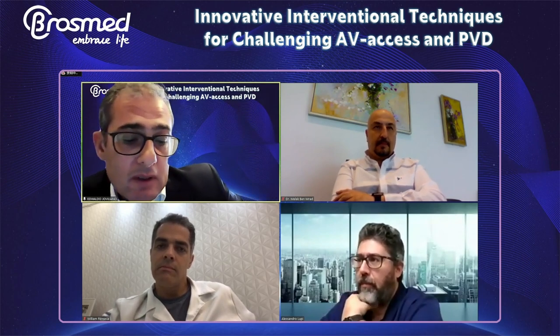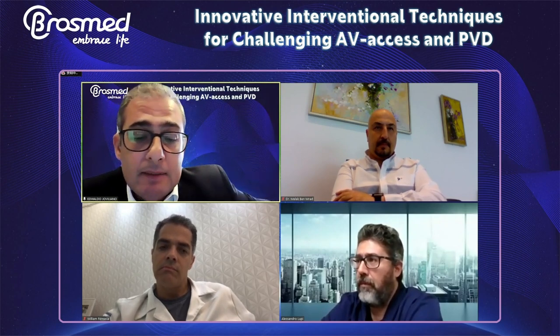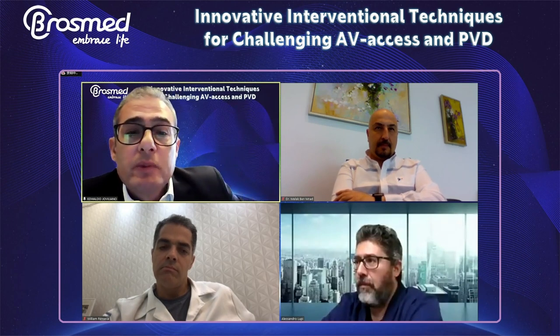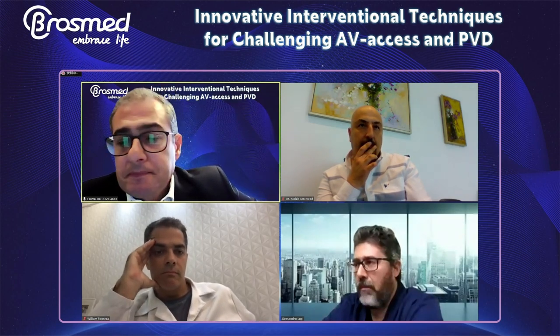Absolutely agree, Dr. Alessandro. Thank you for your comment. I think the scoring balloon is very good to prepare the vessels for the drug-eluting balloon. In our opinion, we have to avoid stents as much as possible in femoropopliteal, popliteal and distal lesions. We can use it first to prepare the vessel, mainly in calcified vessels like this one that I chose. Thank you.